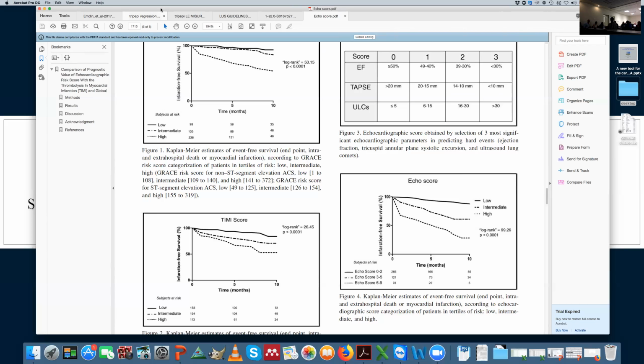Okay, Luna, I have read a lot of your papers, of course, and I am very interested in B lines as a prognosis in patients in the ICU. Actually, when I was studying echocardiography with one of my masters, who is present here, we had a patient doing echocardiography as an outpatient, and at the same time, the patient started to have chest pain, and at the moment when the patient started to mention chest pain, the B lines appeared in all the lungs, okay, and diffuse interstitial syndrome.